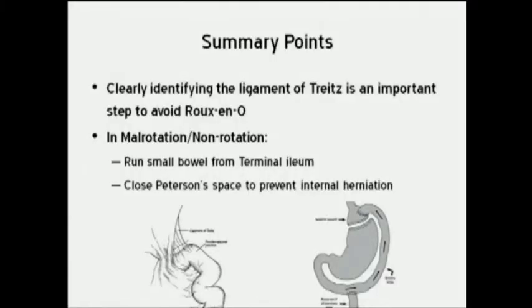In summary, we felt that it is important to always clearly identify the ligament of Treitz in order to avoid construction of a Roux-en-O. Specifically in the setting of malrotation or non-rotation, we thought it was helpful to run the small bowel starting at the terminal ileum, and we also thought it was important to close Peterson's space to prevent internal herniation.